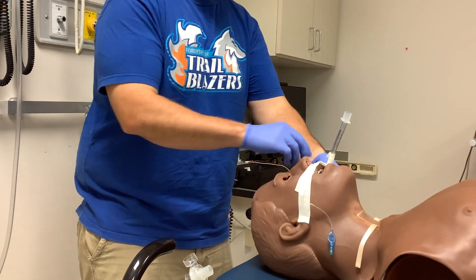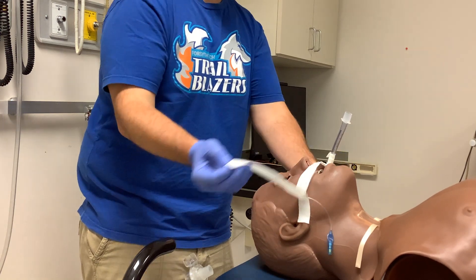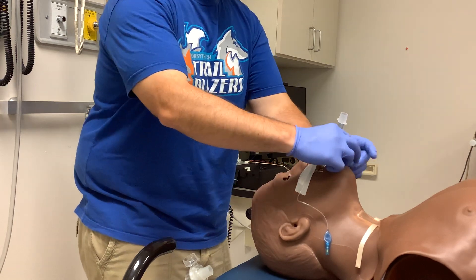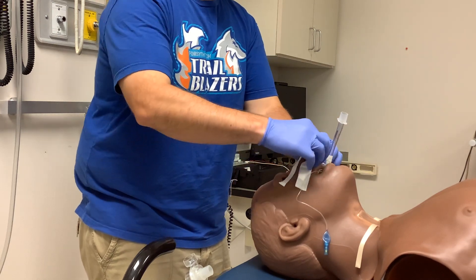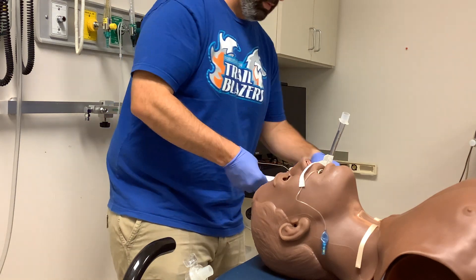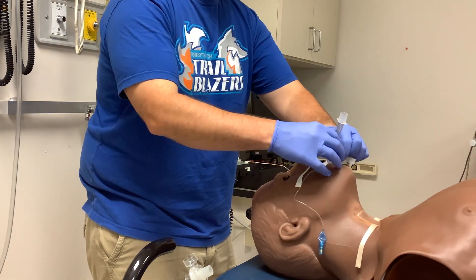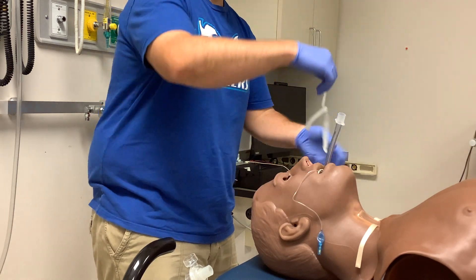The whole purpose behind flagging the tape, as I mentioned before, is so that when it's time to retape or extubate the patient and you need to undo your tape, you can just grab that flagged end and take that strip of tape off. And if you're going to use it again, you can set it aside — that can be reused so that we're not wasting so much tape. Then you can undo the other side as well, and you still have two usable pieces of tape.